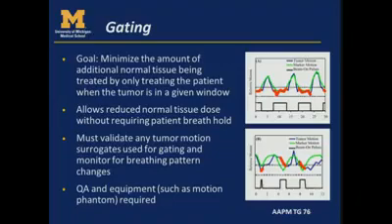In our clinic, we certainly prefer to use a breath hold technique over free breathing, but not every liver or lung patient can actually hold their breath with or without a device. And so gating is a great option for those patients that have trouble with compliance or other issues because it's kind of passive on their part.